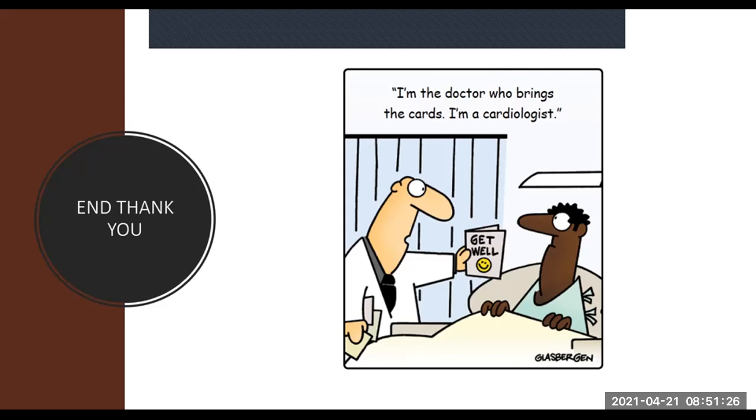All right. The only time they'll get a bit worried is if you're sweating and squinting and looking at the screen like, what the hell is going on here? So just do it. Do it confidently. Even if you're not sure what's going on, they don't need to know that. You're just practicing. All right. You don't suspect cardiac pathology.